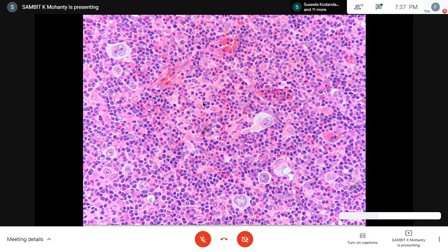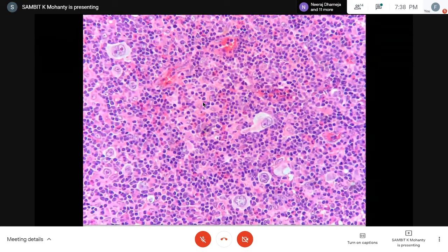So those are cells with aberrant follicular or post-germinal center differentiation. They are not expressing CD45, and PAX5 is dim; they're negative for CD20. The background cells are CD3 positive, big cells are CD3 negative. ALK, anaplastic large cell lymphoma kinase, was negative, and the cells are CD15 and CD30 positive. CD15 and CD30 show Golgi zone perinuclear dot-like positivity. So that confirmed my diagnosis, classical Hodgkin lymphoma.